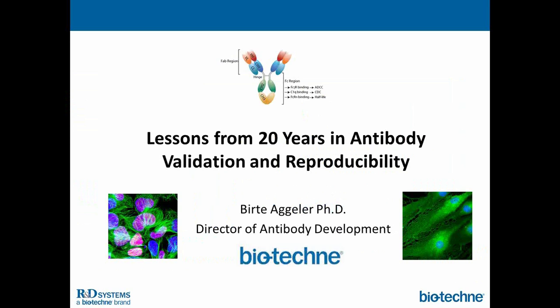I've talked to some researchers that treat that application as the same. However, I would put in one word of caution that IHC does require a very harsh antigen retrieval because you're cross-linking everything to begin with. So I would treat them as 2 separate applications, and that's what we see when we actually screen.